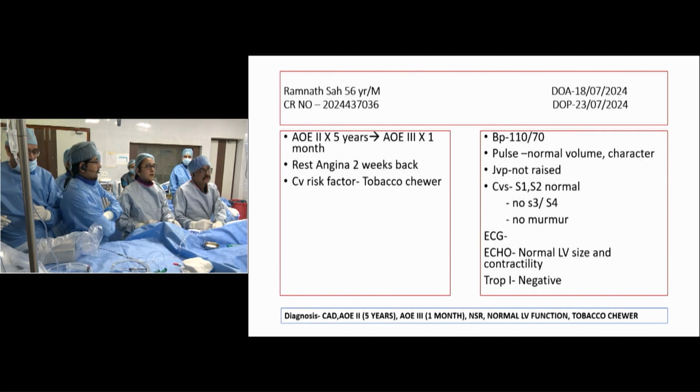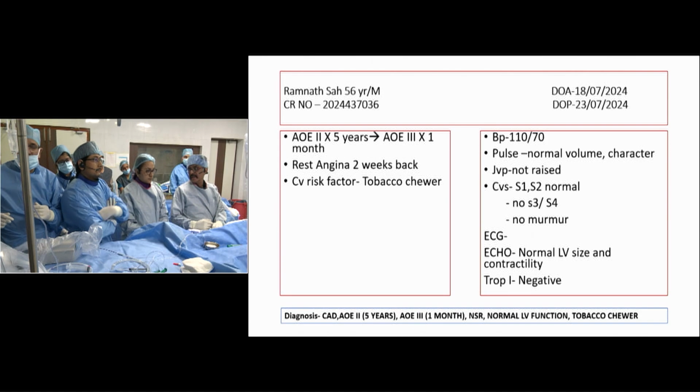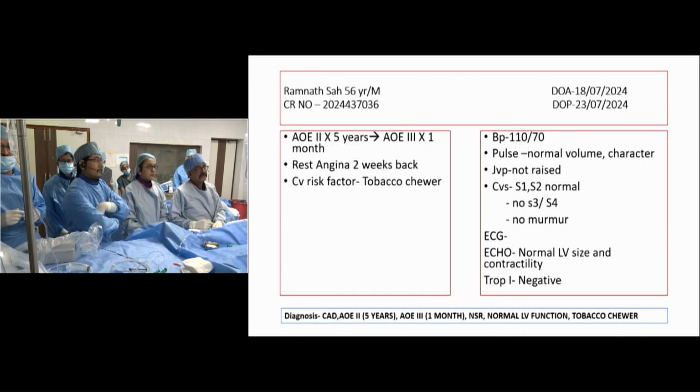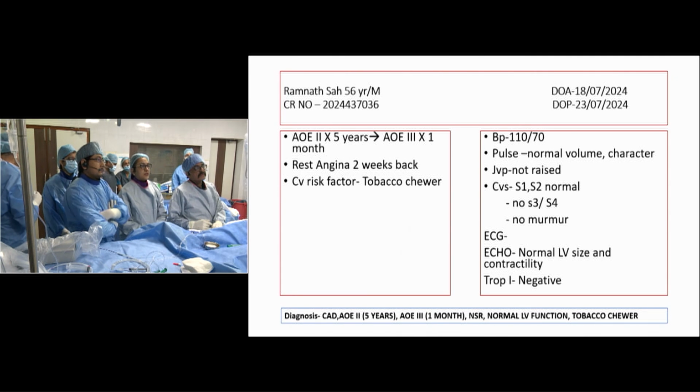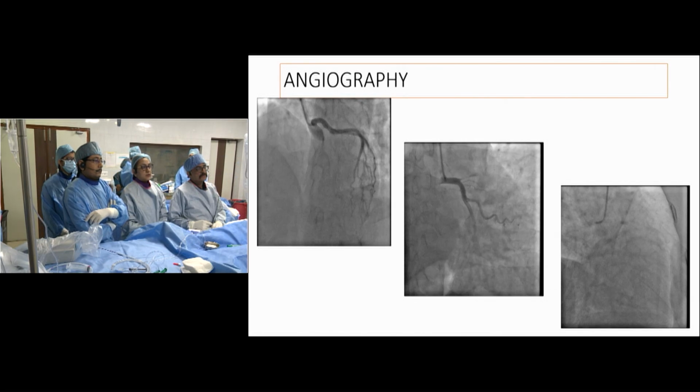Yeah, thanks, Dr. Rupali. Thanks, Dr. Ankit. So, as both of them summarized, this looks like a patient who had some chronic symptoms and has had some recent worsening, isn't it? And if you see the current angio shots, can we come to the recent angio? Can we remove the slides and come to the recent angio? Shift to angio.